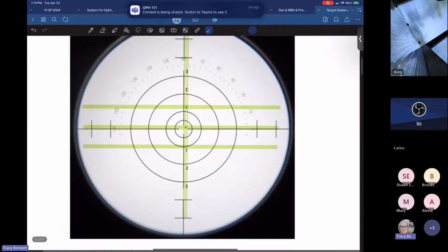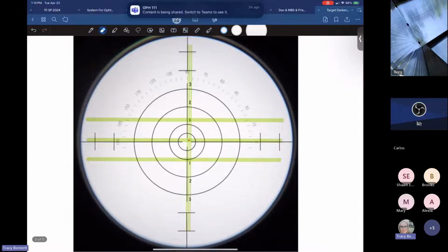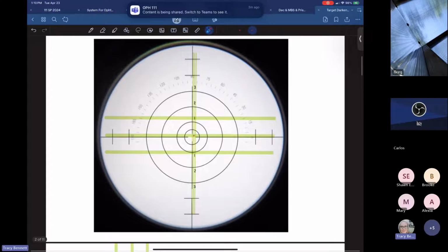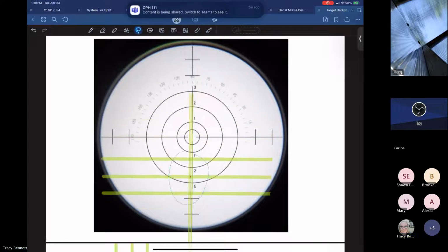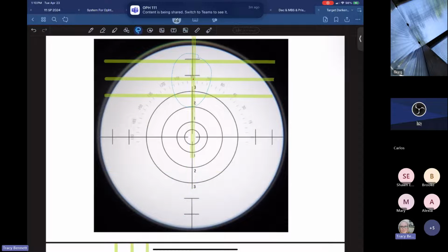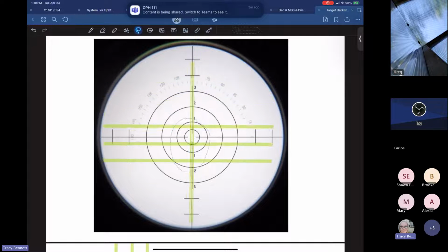That's by using that chrome knurled sleeve up near the eyepiece. I don't know if I have a picture of the lensmeter. You can move this around to the different positions. But for these, we're just going to keep them in the 90, moving up and down. So vertical meridian, 90 prism, up and down, or on the 180, in and out prism. Okay, so there's base in, base out, base up, base down.